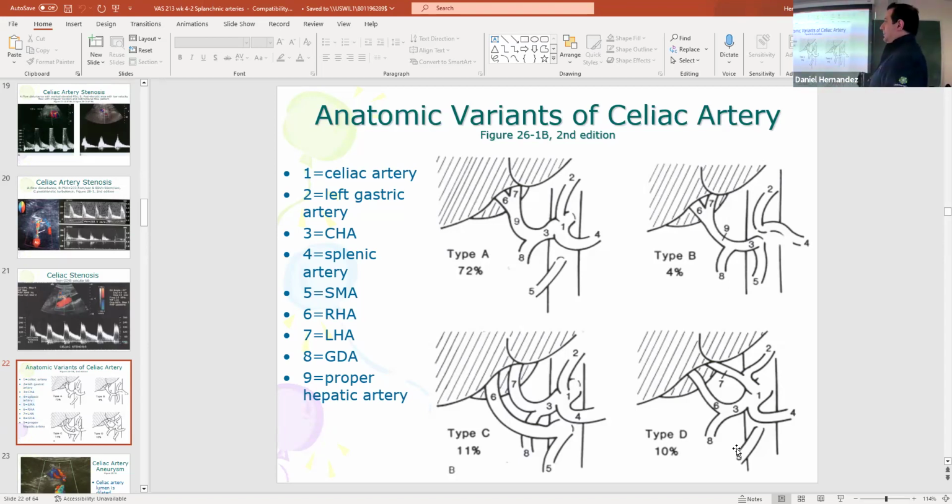Rochelle, her hepatic artery, I think we decided connected to her SMA. Yeah, so she was like this guy. So we were following, trying to figure it out. And it was a little tricky, and we're trying to scan, but I see the hepatic artery, beautiful, but we couldn't connect it back to her celiac artery for the life of us. We're scanning, trying to figure this out, and we find out that it actually connects to her SMA. She does have a celiac artery. We see the splenic artery, we see the celiac artery coming off, we see the splenic, beautiful. We couldn't really visualize the left gastric, but we just couldn't get the one branch, so we were joking that her seagull was flying in circles because it only had one wing. That was our joke. But yeah, we eventually found it connecting to her SMA.